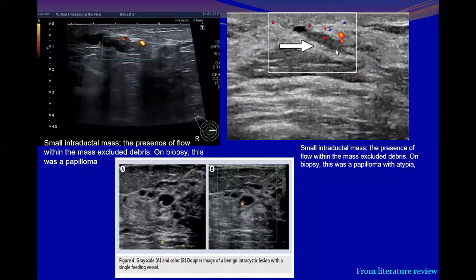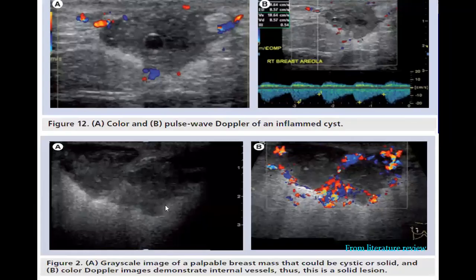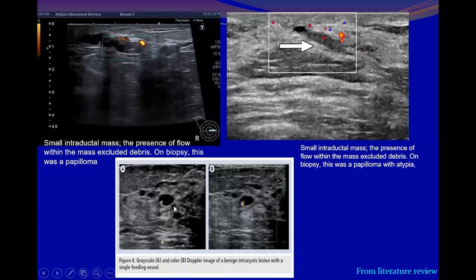These are examples of a duct demonstrating intraductal vascular echoes. That means these definitely are not nonspecific secretions. These are soft tissue. We have to go further to exclude or to give a pathological diagnosis for this soft tissue. In both of these cases it was a papilloma. While in this complex cyst, there is a soft tissue component with feeding vessels here. We cannot decide before Doppler.